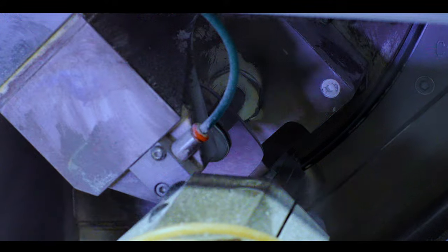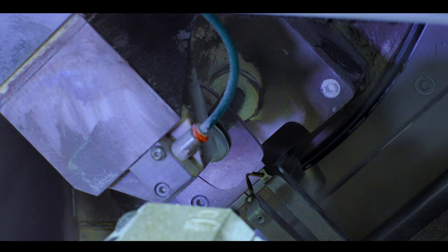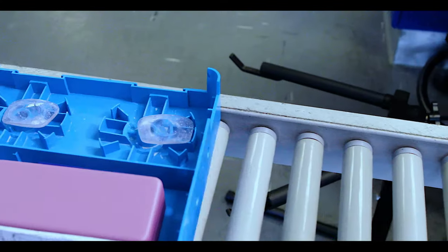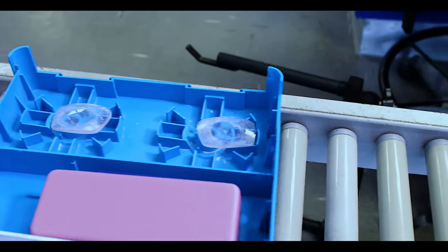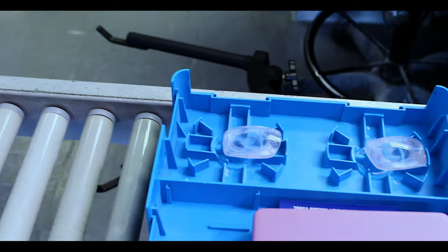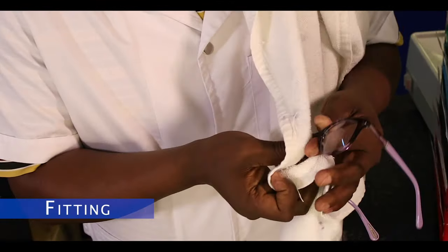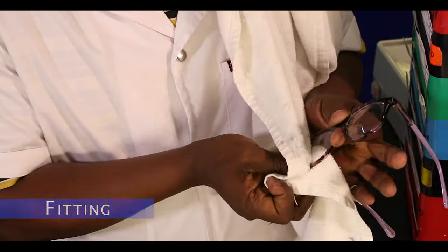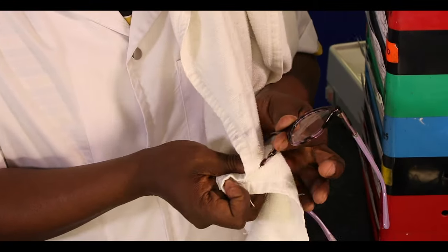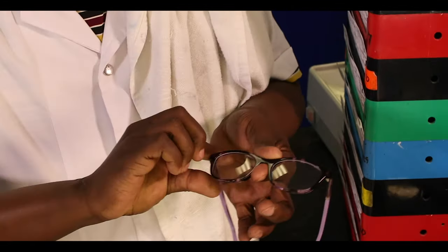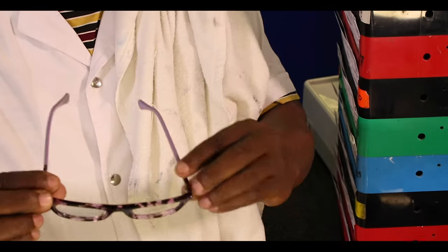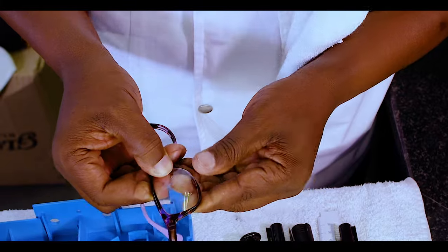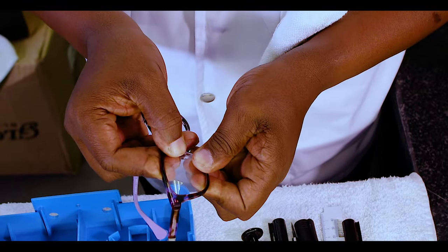The cut lenses to the correct size are ready for final inspection and insertion into the frame. During final inspection, a technician checks the finished lenses for scratches and imperfections. They also fit and orientate the lenses into the frame.